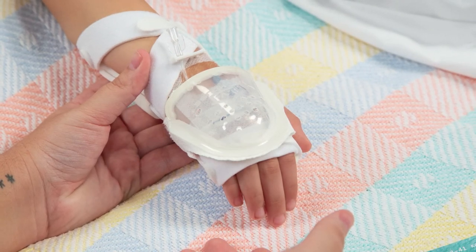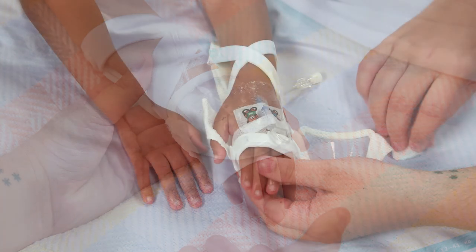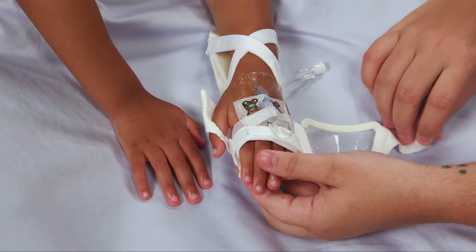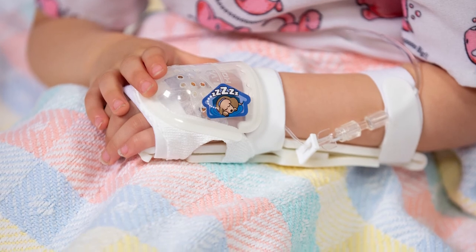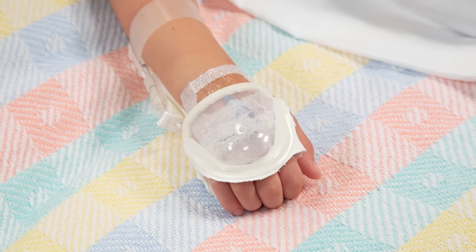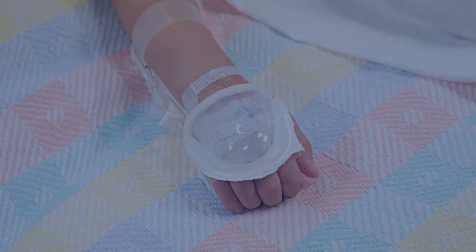Early detection and intervention of IV site malfunction is essential to eliminating serious injuries. Change the IV House UltraDressing for each new IV insertion. Removal of the device does not harm skin or pull hair. For additional stabilization of the joint, the IV House UltraDressing is designed for use with the TLC splint. All IV House devices comply with CDC guidelines and the 2016 Infusion Nursing Standards of Practice.